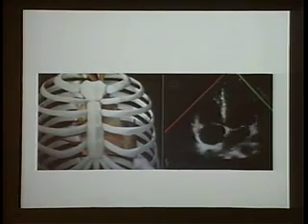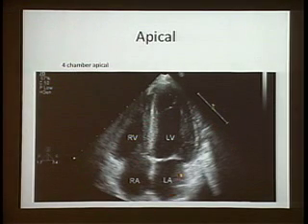And this is what you should be getting. Again, the structures are very easy to recognize. This will be your lateral wall, septal wall. This is your mitral valve, your LA. You can measure here all kinds of diameters if you want to assess dilation or volume status. You can put Doppler color here to see if you have MR or TR, all kinds of things. You can see the relative size of both cavities to assess whether the right heart is dilated or not. Very powerful view, very powerful view.